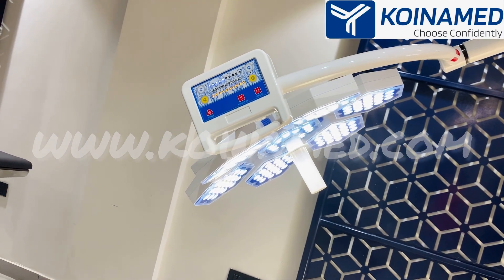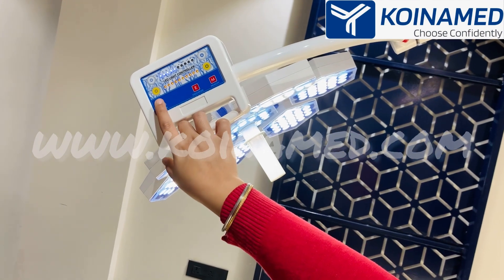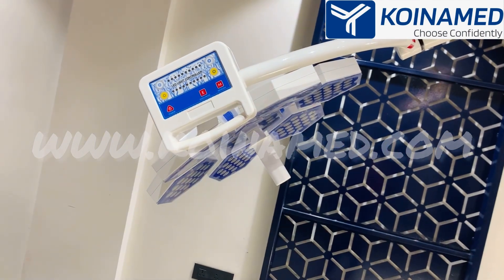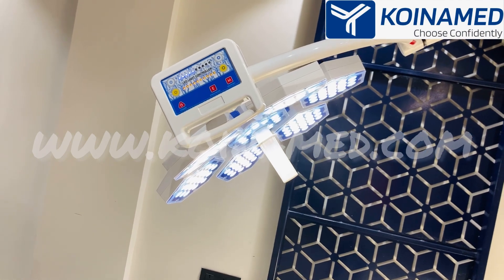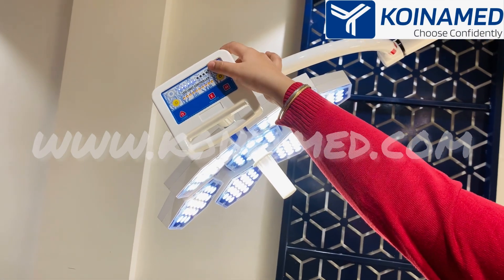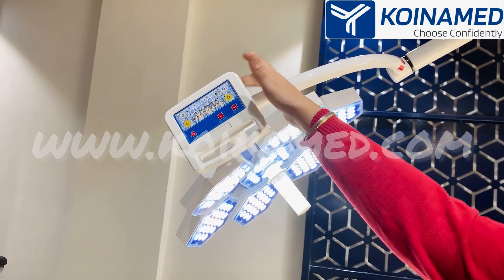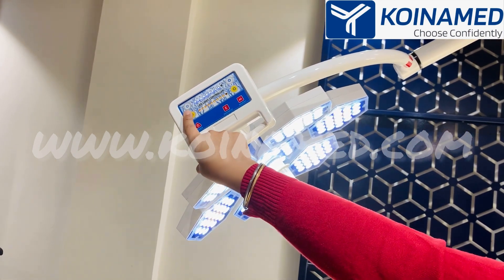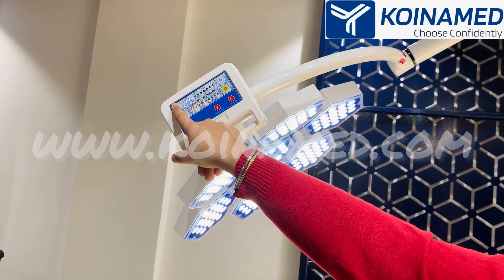We have provided a touch controller for operating this light. This is the power on and off button — from a single touch you can power on and off. From here you can increase the white light, and from here you can increase the yellow one. From here you can decrease the yellow one and from here you can decrease the white one.